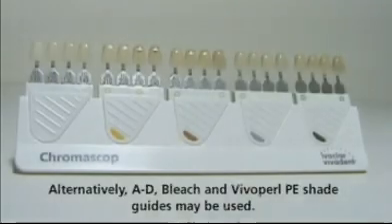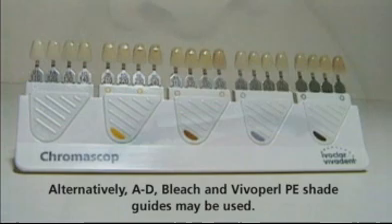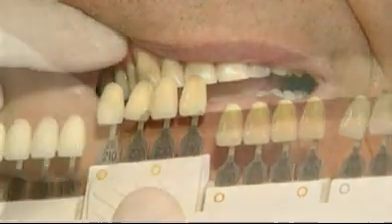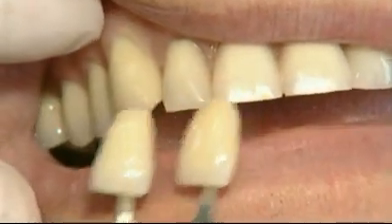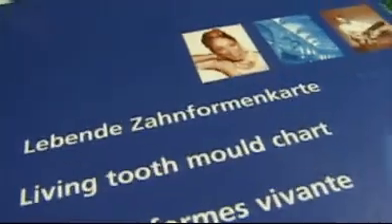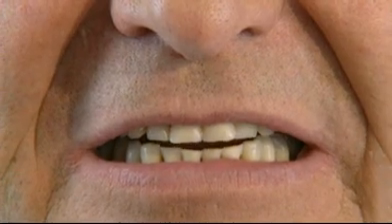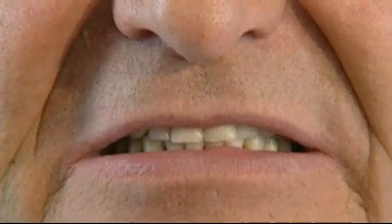The shade is determined by means of the chromoscope shade guide. The living tooth mold charts provide further assistance in selecting the appropriate shape and shade of the teeth. The initial situation. The current oral situation of the patient shows clear deficiencies. This finding is confirmed by the profile, the physiological rest position, and the centric position.